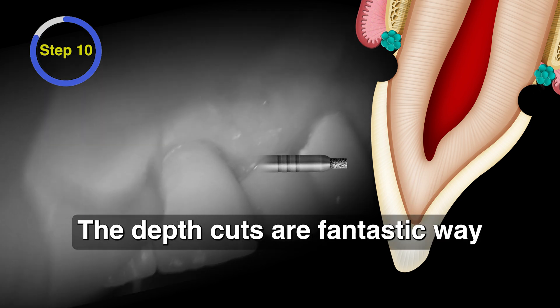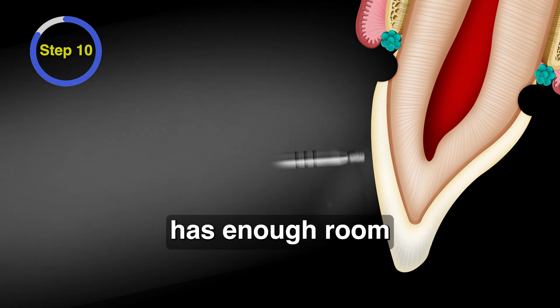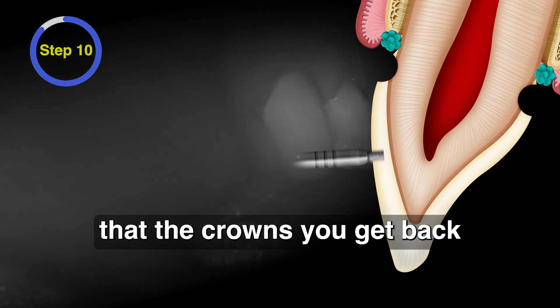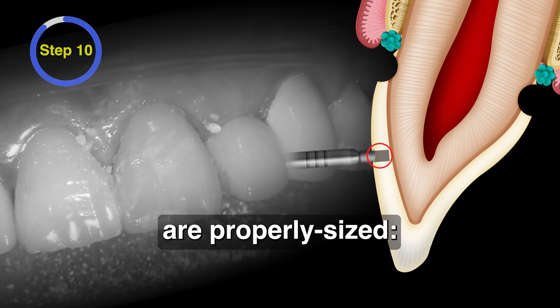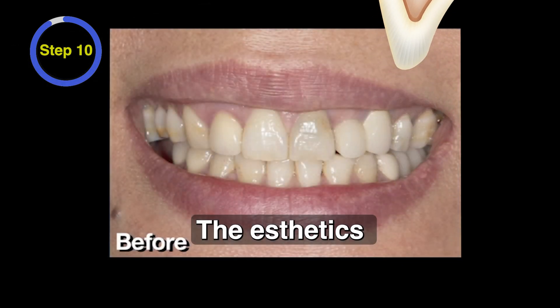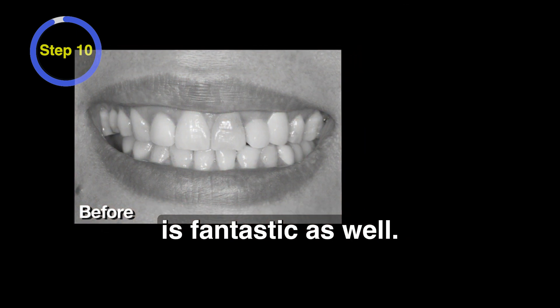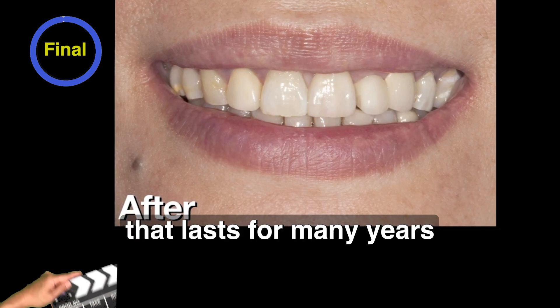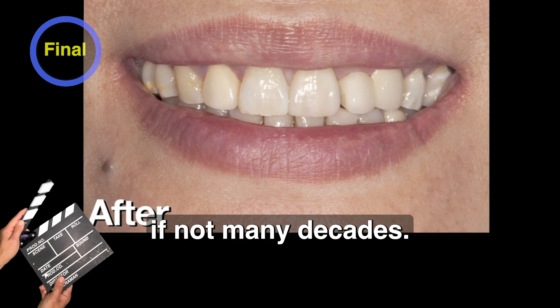The depth cuts are a fantastic way to ensure that your technician has enough room to do whatever they need to do. You'll start to notice that the crowns you get back from them are properly sized — the same size as the teeth they were replacing — and the aesthetics on those restorations is fantastic as well. You'll also have enough thickness in place to do an occlusal adjustment, and you should end up with a crown that lasts for many years, if not many decades.